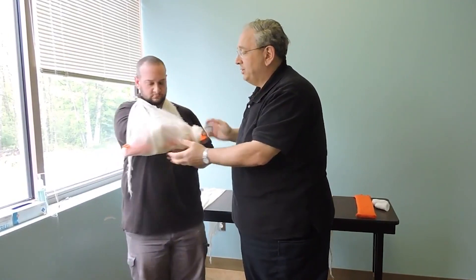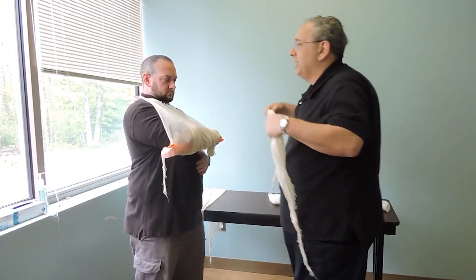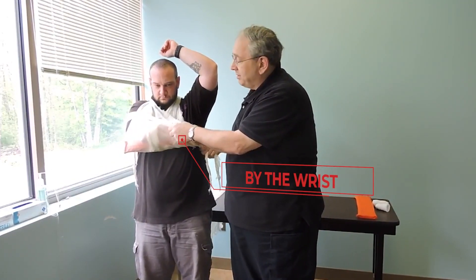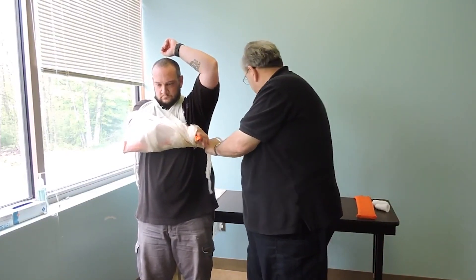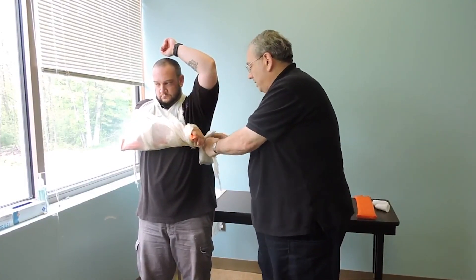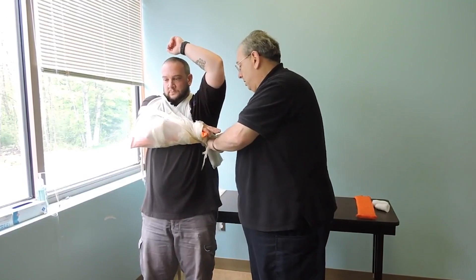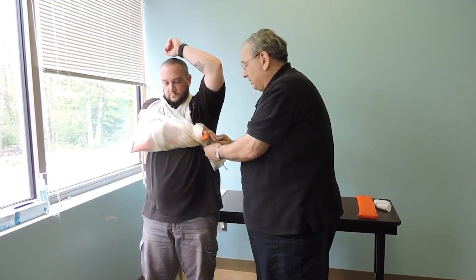That's supporting the arm, but I don't want this arm to move back and forth. I still need to secure it with a swath against the patient. I'm coming down and up — I'm going to catch this by the wrist. I don't want it on the side of the fracture; I'm going to catch the wrist. I'll add a piece of padding, tie the surgeon's knot, pull it tight, have my patient inhale, snug it down, and tie it a second time.